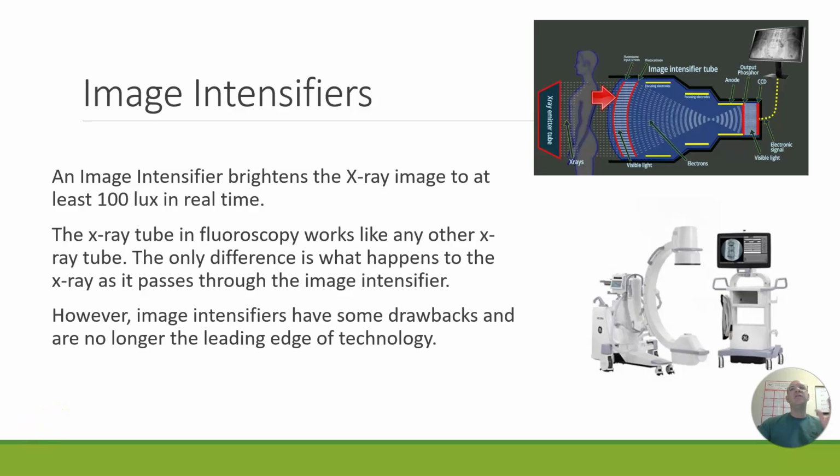Now, image intensifiers are going away because flat panel plates are taking over. They're a little bit more simple. They're lighter. There's less that can go wrong with them as far as maintenance goes. I think that the flat panel detector is going to take over image intensifiers fairly soon. But they are still around, and they are still on the registry, so you should know all about them.